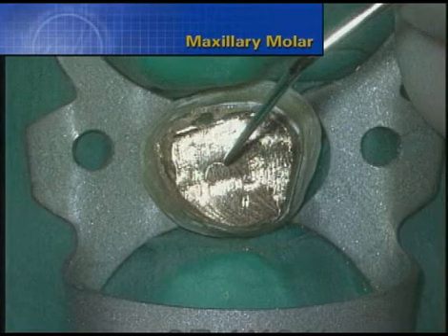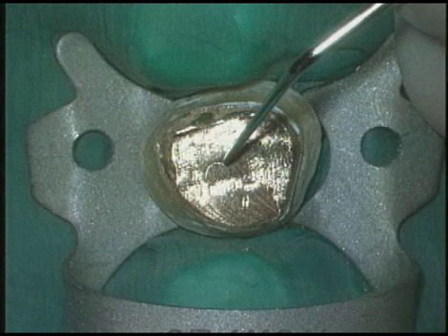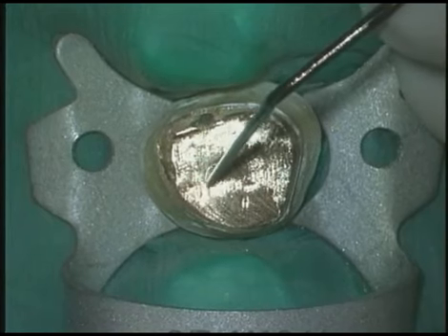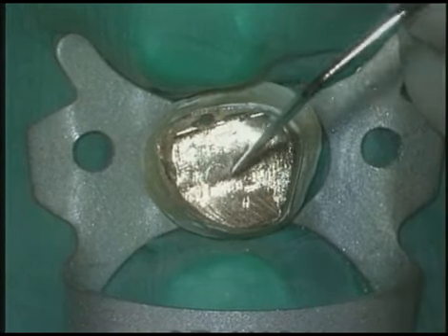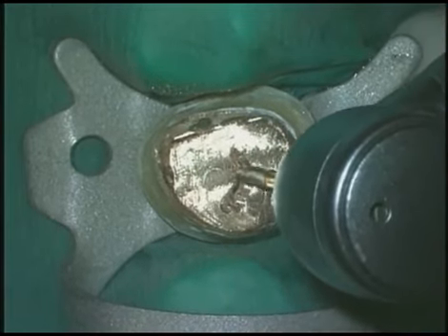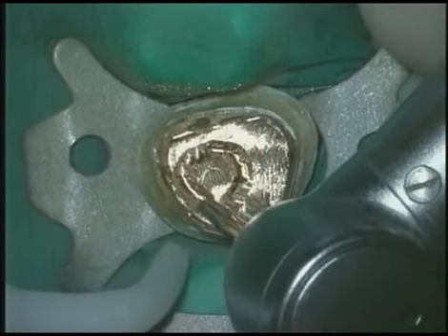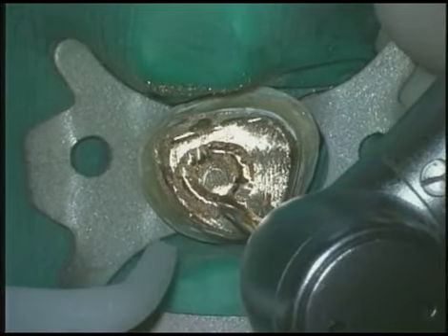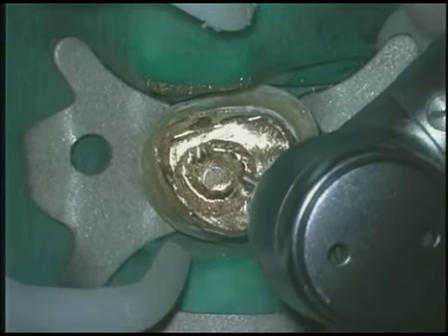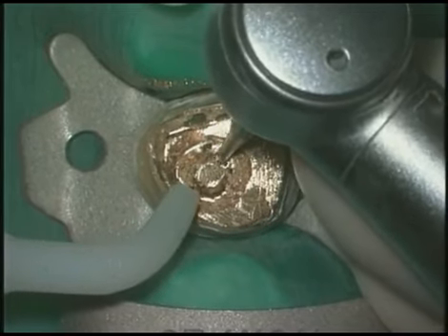Now let's look at a maxillary molar with a cast gold core and interlocking post systems. My checklist is to think, plan, visualize, execute. The explorer outlines the palatal post. Transmetal burrs are again employed, but notice that I am removing core material quite far away from the actual palatal post. The burrs tend to chatter as we cut on gold, and if we chatter, we can bounce into the post and we could needlessly reduce its cross-sectional size.